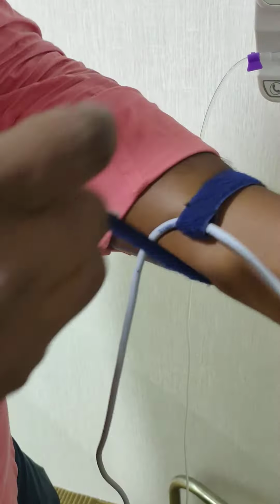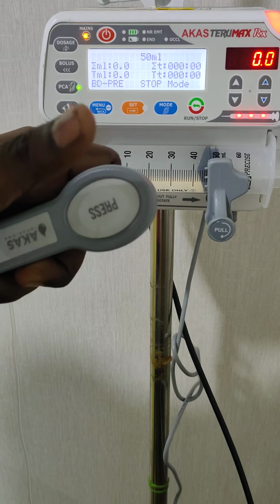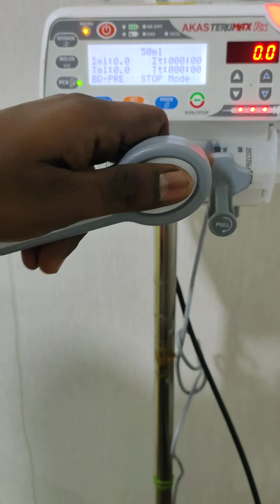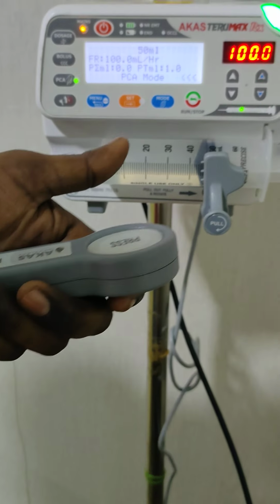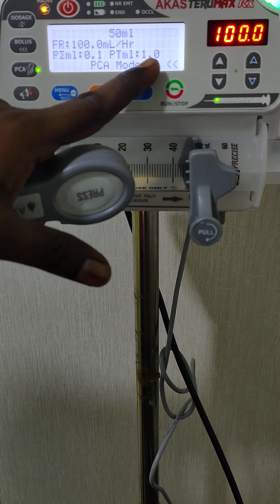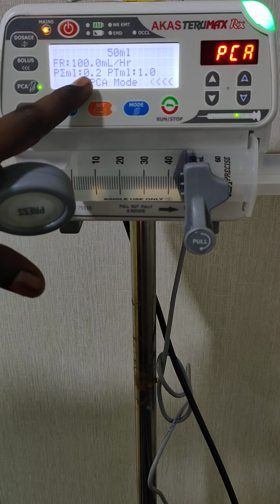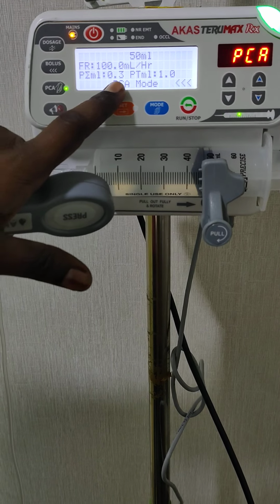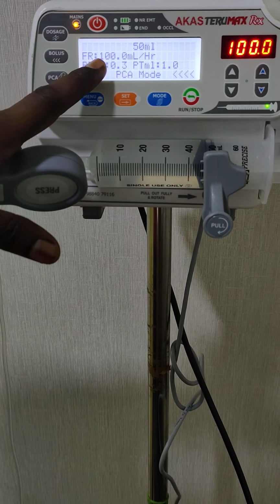So here you see the machine is in stop mode, non-run mode, but even so the PCA will work. Now the patient is demanding the first dose. See, I am pressing it. Okay, now I pressed. This is the first dose, and it is running. Target ml is 1. The infused ml you can see is 0.1, 0.2, 0.3. It keeps increasing at 100 ml per hour.